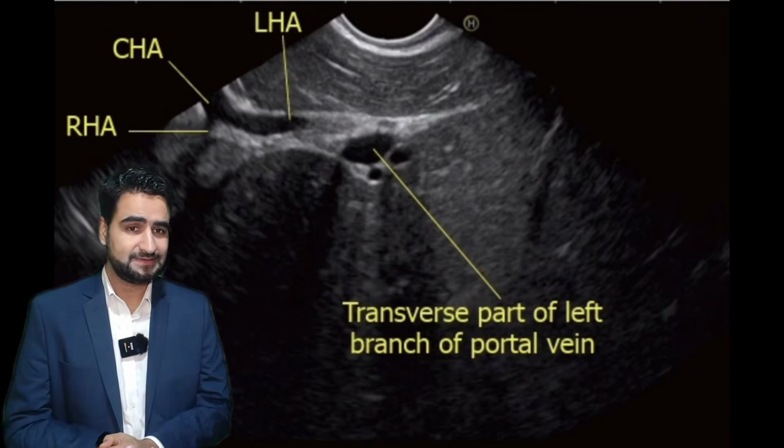To summarize, from Station 1 EUS imaging, we can sequentially identify key anatomical landmarks. One, the portal vein branch to segments 2 and 3, basic orientation of left lobe vasculature. Second, the fisheye appearance of the umbilical part of the left portal vein, a crucial orientation marker.